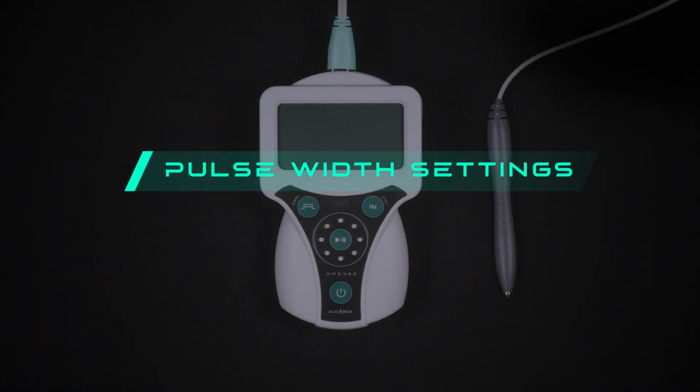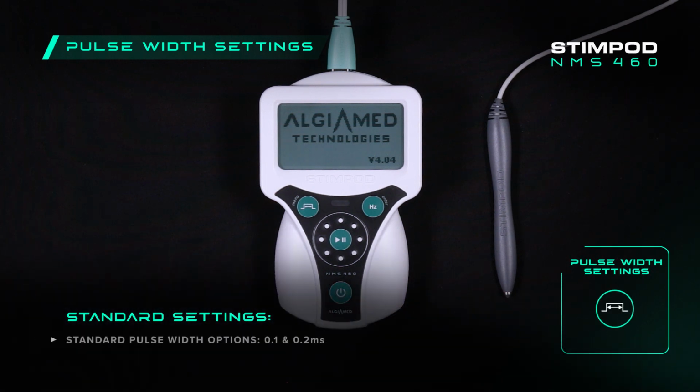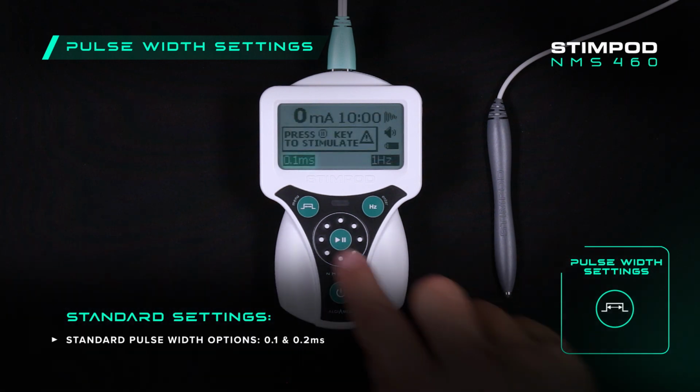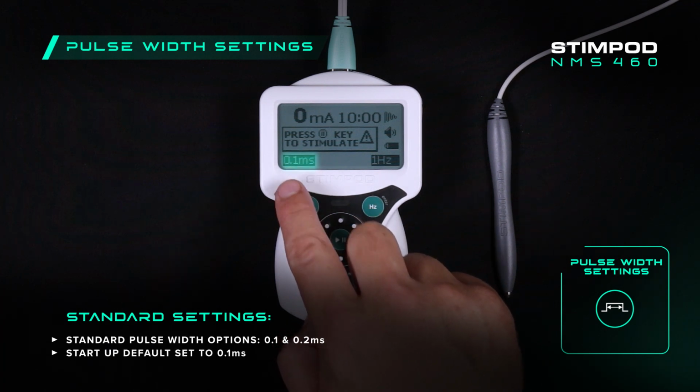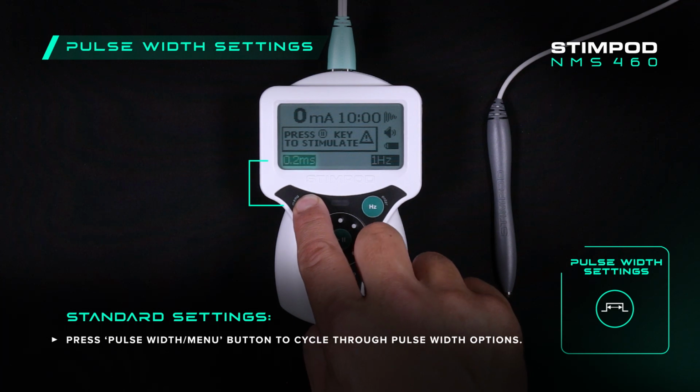Let's go over the Stimpod NMS460 pulse width settings. There are two options available, 0.1 and 0.2 milliseconds. When you switch on the Stimpod, it will default to the 0.1 millisecond setting. You can cycle through the settings by pressing the pulse width button, which is also the menu button.